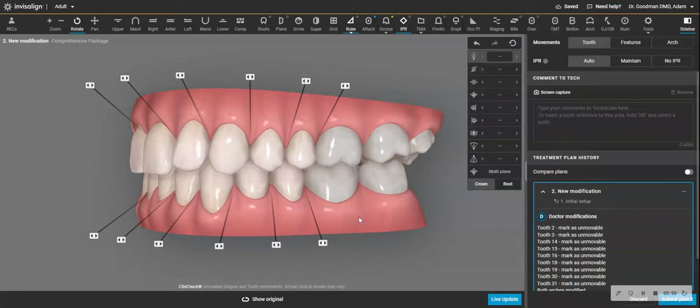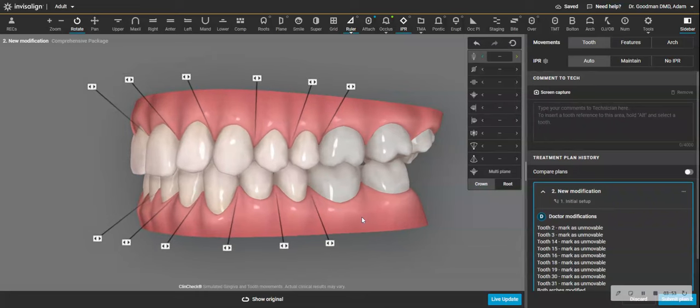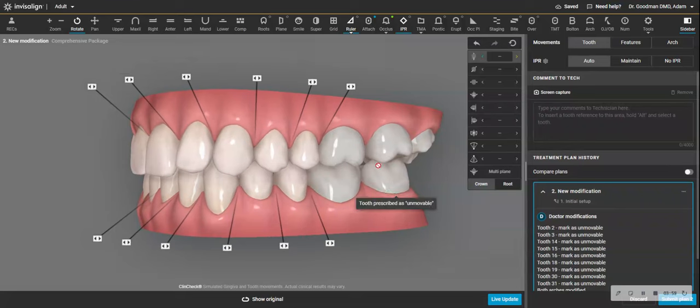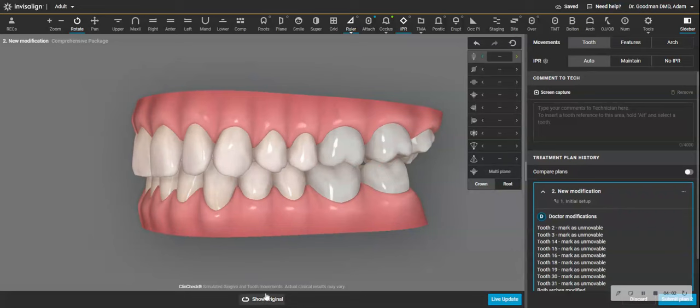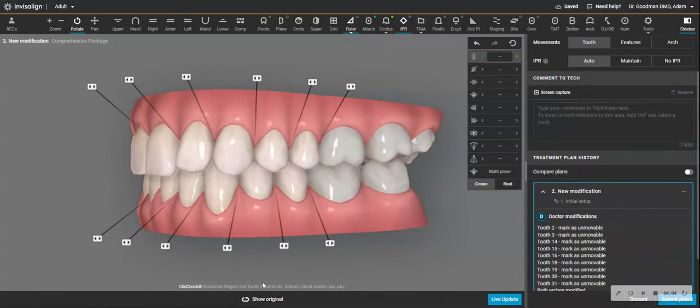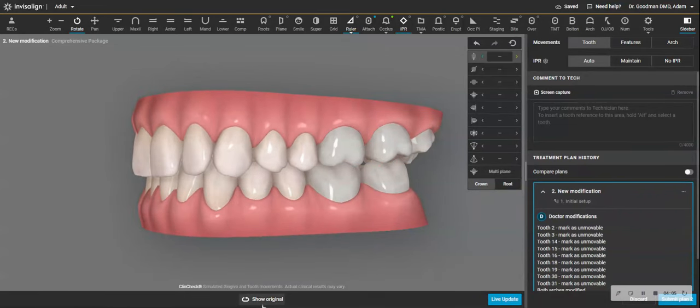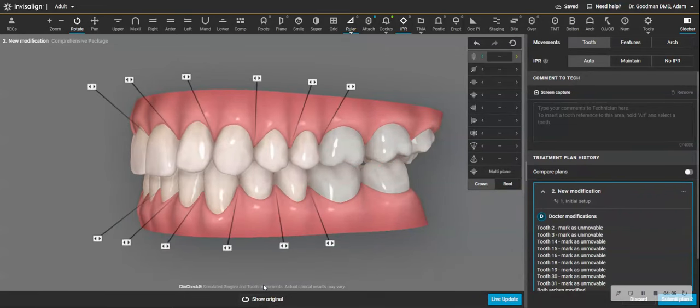We don't want that. And I have had many people come in to me after having Invisalign treatment or even more so Smile Direct, where they programmed every tooth to move and they have posterior open bites from movement that didn't play out. So this ClinCheck can do everything it had in it before and you leave the molars where they are.